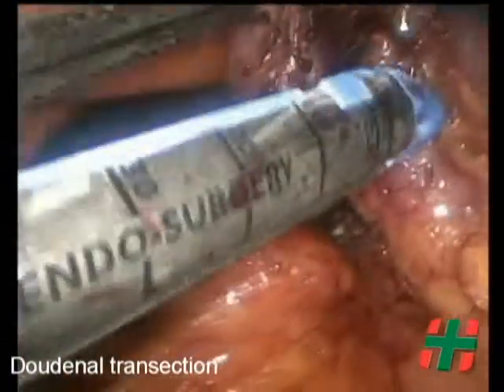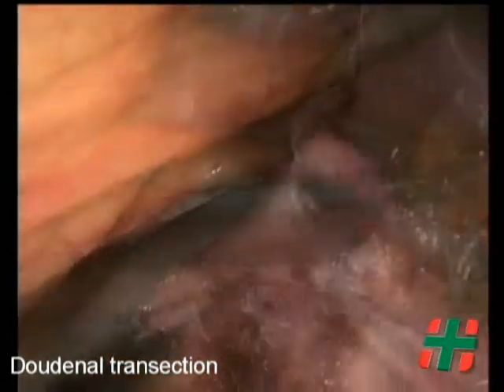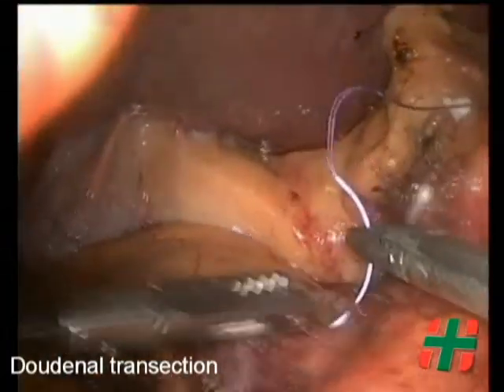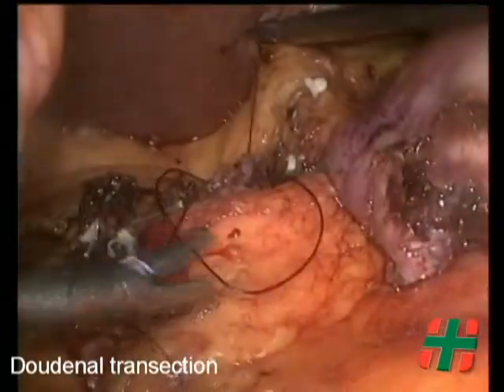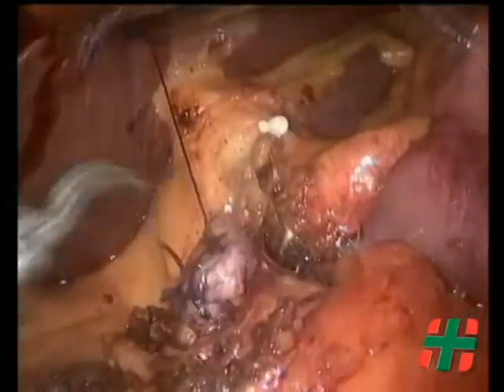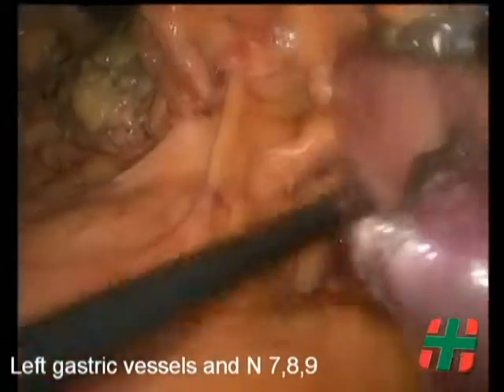The duodenum, just distal to the pylorus, is transected using an endoscopic linear stapler. We reinforce the staple line with a running 3-0 absorbable suture.